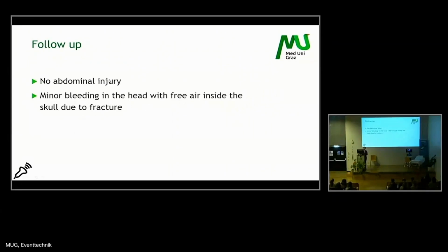So no abdominal injury. She had minor bleeding in the head due to her head wound and a little bit of free air due to a skull fracture.